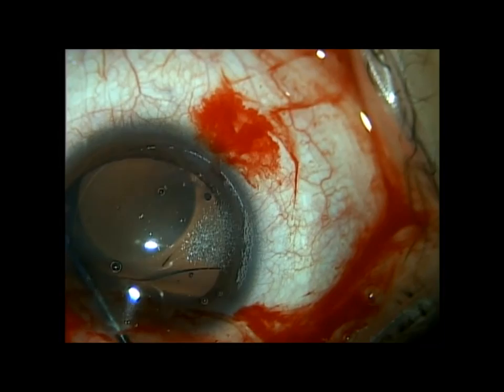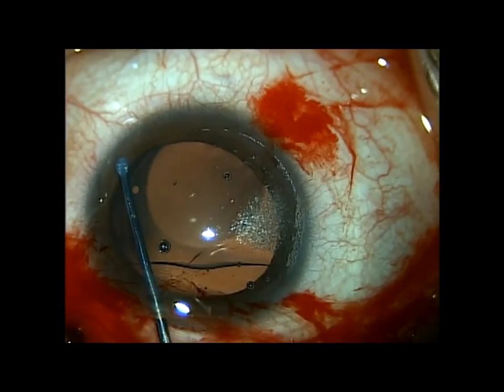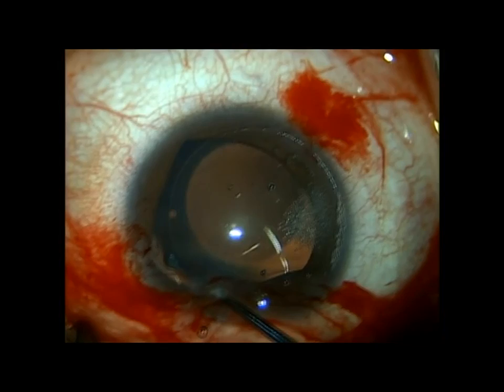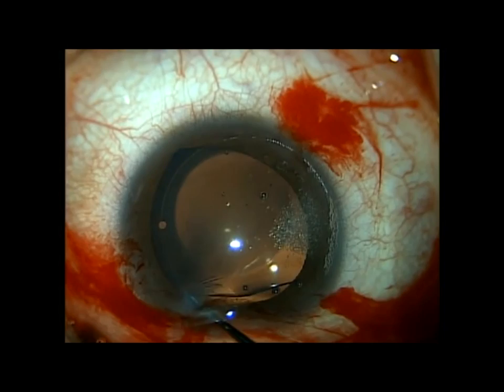You can see the intralase flap there — I made about an 8.5 millimeter intralase flap set at 100 microns. In about three weeks I'll go back and lift that flap for the first time. I created it about five minutes before we brought the patient back to the OR, so I did not lift it today. I've just tucked two of the four footplates underneath the iris and I'm going to tuck the other two on the right side.